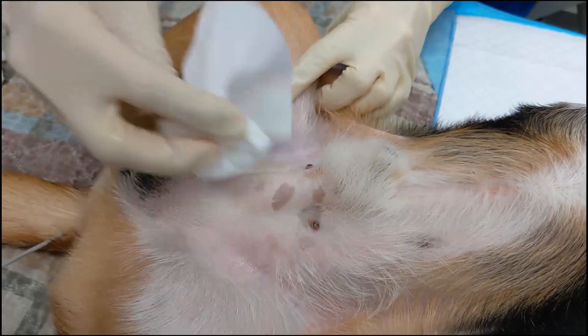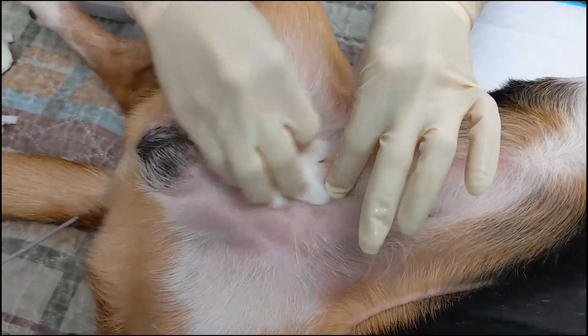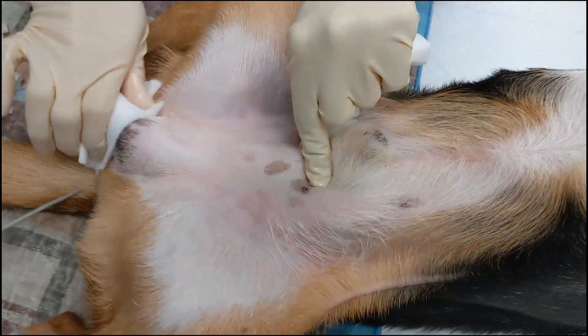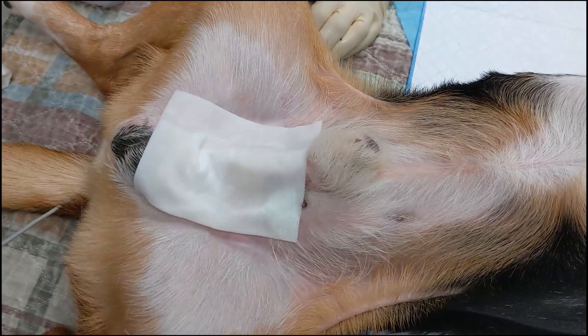The dirty scrub is continued until the gauze wipes away relatively clean. Depending on how dirty the dog is, this typically takes between three to five rounds of alternating scrubs with chlorhexidine and isopropyl alcohol or sterile saline. Before transport to the OR, chlorhexidine-soaked gauze is placed over the surgical site to keep it clean and continue with contact time.